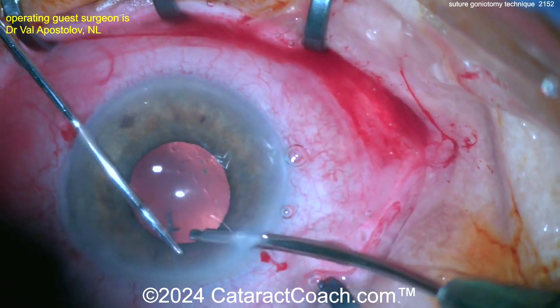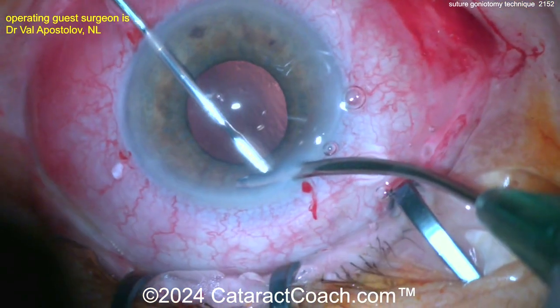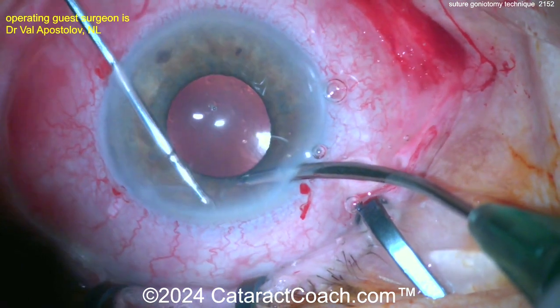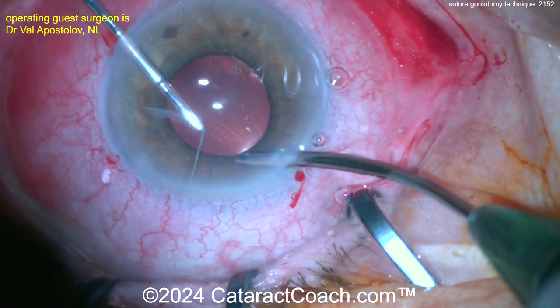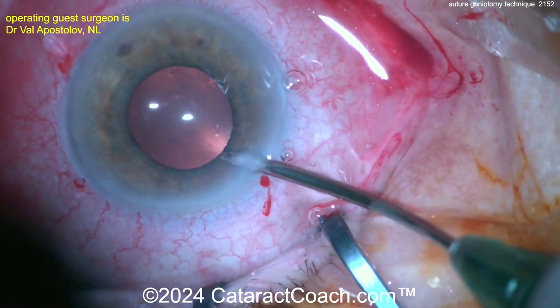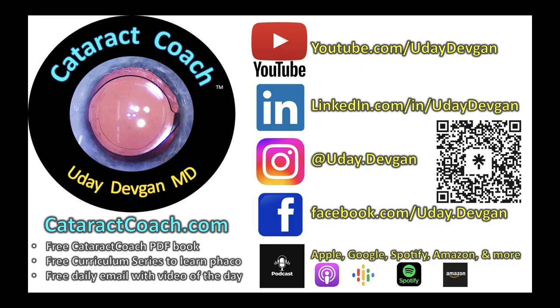This patient has a really beautiful outcome. You've got the IOL in the capsular bag, the goniotomy done with that 5-0 prolene suture, and the patient has good vision from the cataract surgery along with good intraocular pressure control for the glaucoma. Look at that strip being pulled right out of the eye — nice case! Thank you for sending it in. Check out the website and the CataractCoach podcast, and we'll see you in Boston for the ASCRS course.